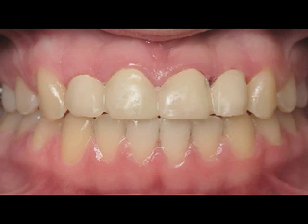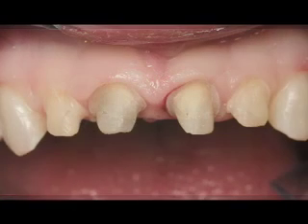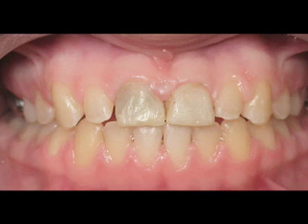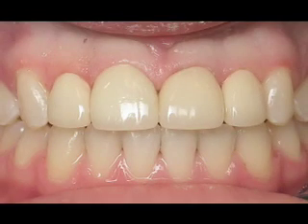Here is 48 hours post-op, and our young patient reported no discomfort whatsoever with the entire procedure. After two weeks, the provisionals were removed revealing excellent healing, and this is immediately after cementing the restorations. With the use of the laser, note that there is no shrinkage away from the gingival margins. Here is the pre-op and here's the post-op of the work that we have done with the restorations.